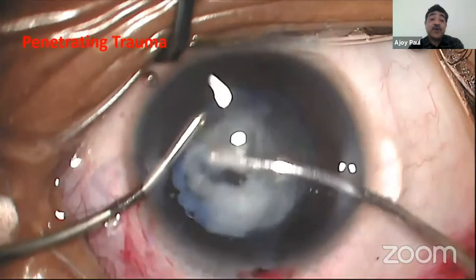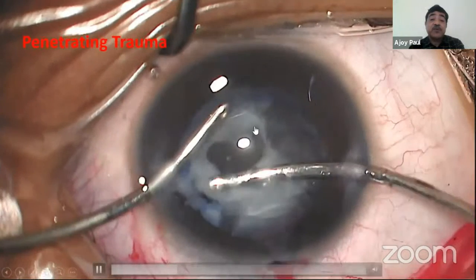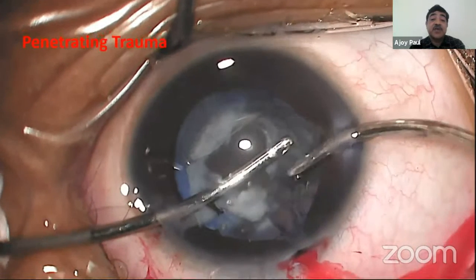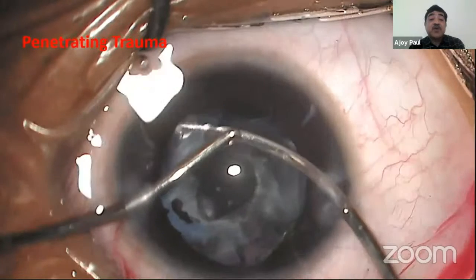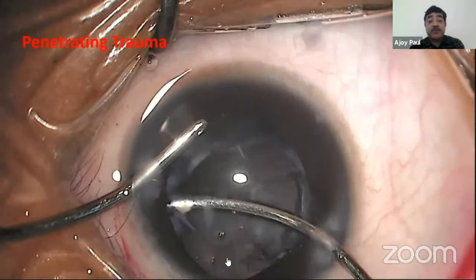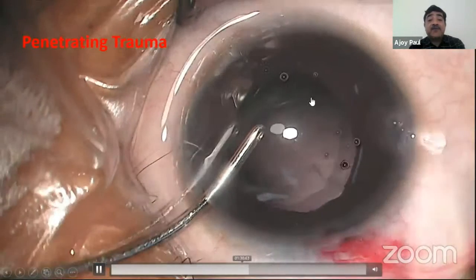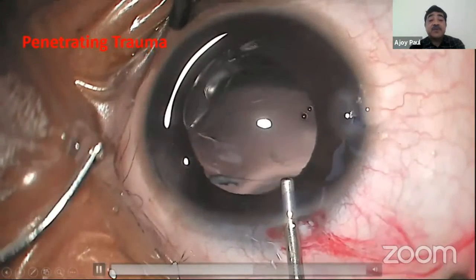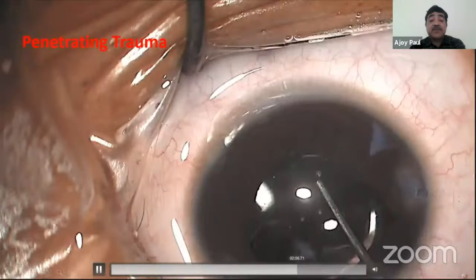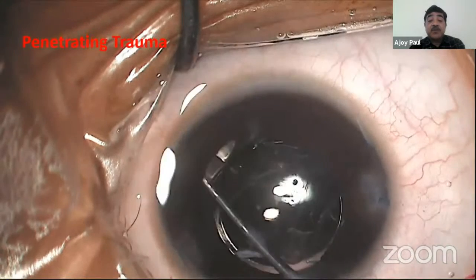And as I go forward, I do see a big break there. But fortunately, as you can see, I'm already pulling on the margins. There is a little bit of vitreous there, so I stop there and do not go into the central part. Go to the periphery, take out all the cortex, the cortical matter from the periphery. Once I do that, I go ahead with the vitrectomy, and then I have enough space there, and put the lens in the sulcus.